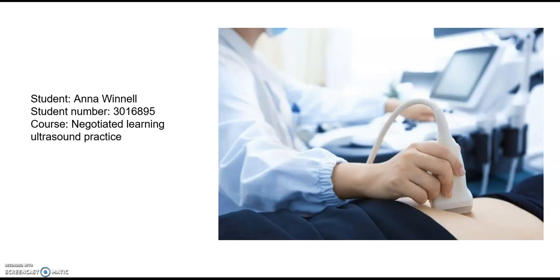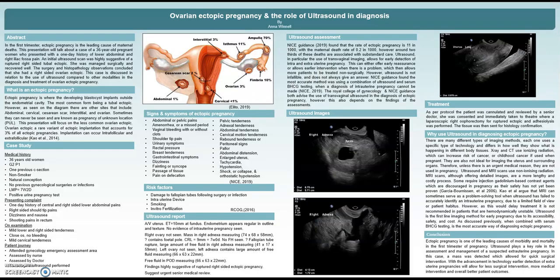I'm a Band 5 gynecology nurse studying medical ultrasound practice to be an early pregnancy sonographer. The title of this presentation is Ovarian Ectopic Pregnancy and the Role of Ultrasound in Diagnosis. In the first trimester, ectopic pregnancy is a leading cause of maternal deaths.